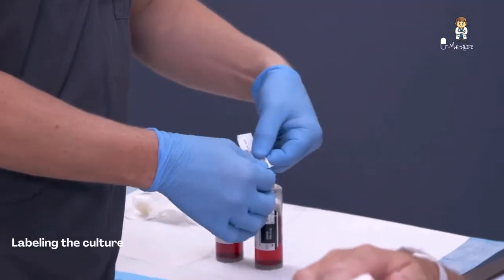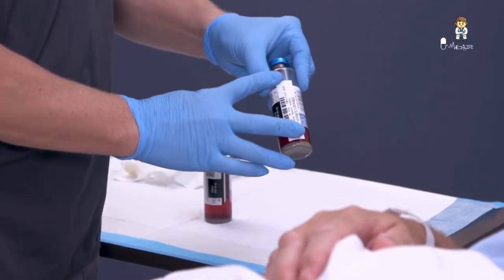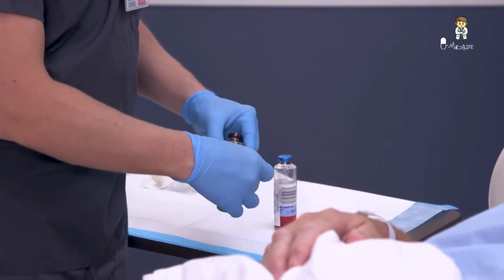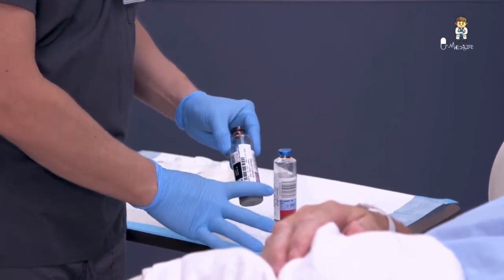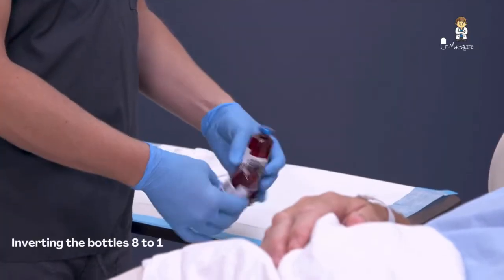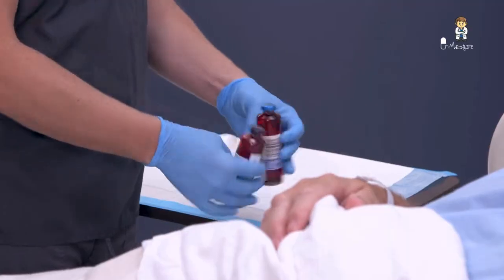Label the culture bottles with the patient's name and identification number, the date and time of specimen collection, and the contents of the culture bottles in the presence of the patient to prevent mislabeling. Consider mentioning what antibiotics the patient is on if applicable. Invert the bottles eight to ten times gently to mix the blood adequately with the medium inside the bottles.